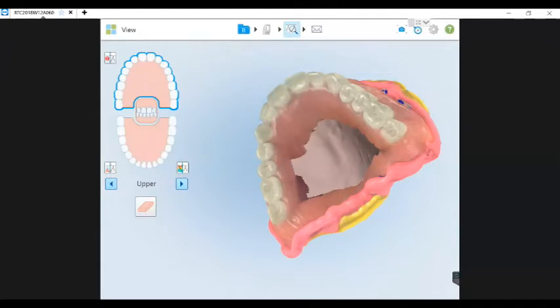And I'm sorry, there's a chat question here. What are the steps for the edentulous person who does not have a denture? So great question. And that process is going to be to scan the oral cavity, right? You could take an impression and scan the impression and send that. It's important to you to keep the entire workflow digitized, but it's not necessary. You could also, so you can take a physical impression, or you could scan the oral cavity.